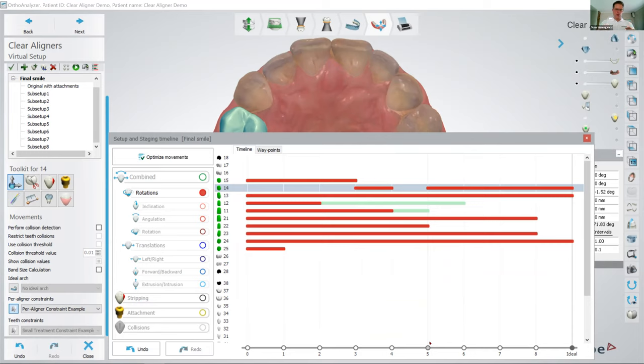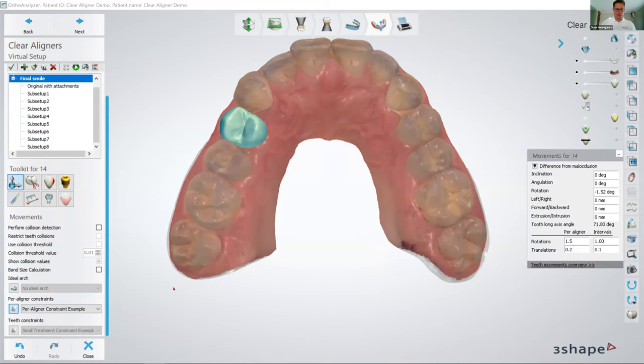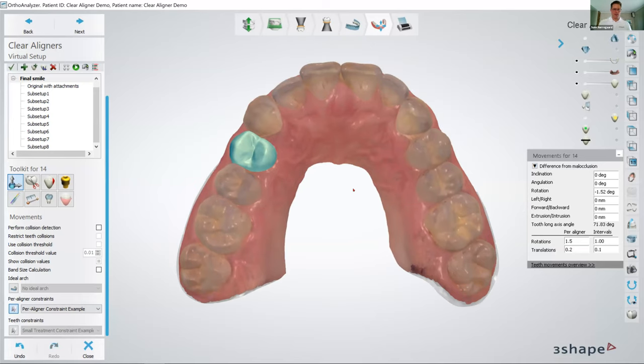So this is just to show how you dig into the aligner treatment and take control of what is happening at what state, at what aligner, and how fast this is going. So super powerful tool here in the orthodontic clear aligner studio software. All right, enough about the teeth movement. I think you get the idea more or less without me going completely into depth about the whole situation.